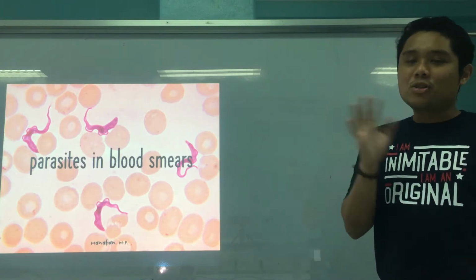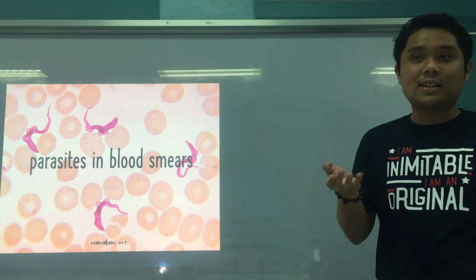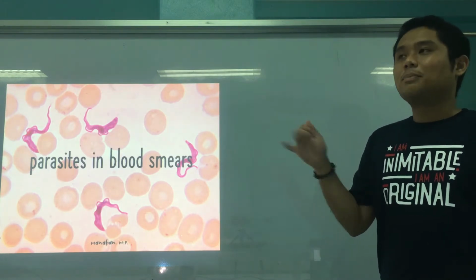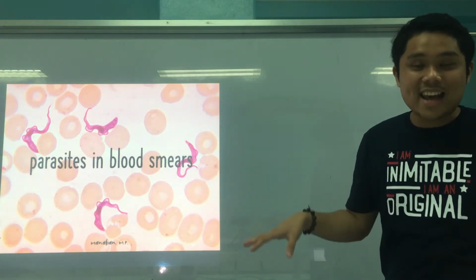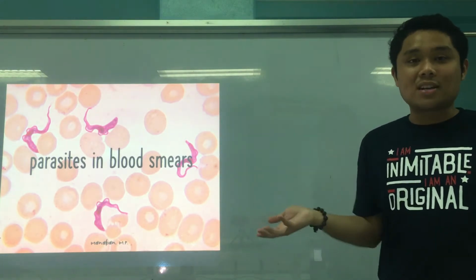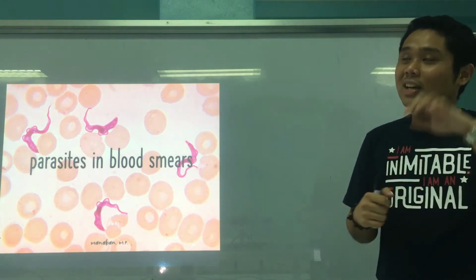It has the same format as your discussion and handout on parasites in fecal smears, but now we're focusing on blood. This is our second to the last lecture. Our last lecture will be immunoassays, and we're almost done. Alright, and we're done with clinical parasitology.